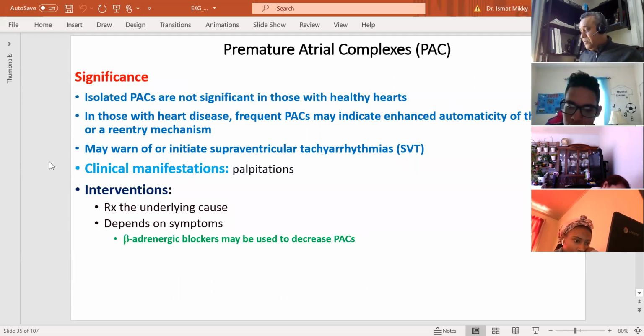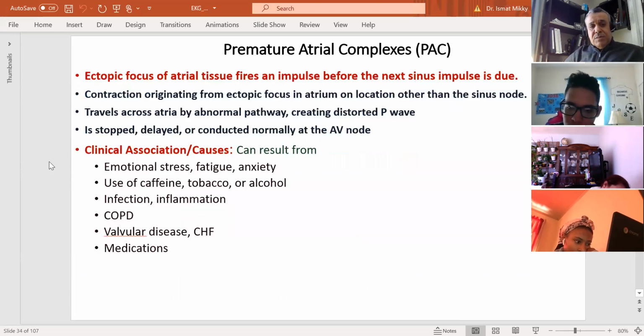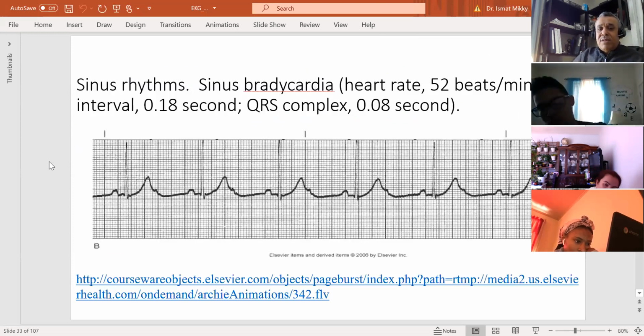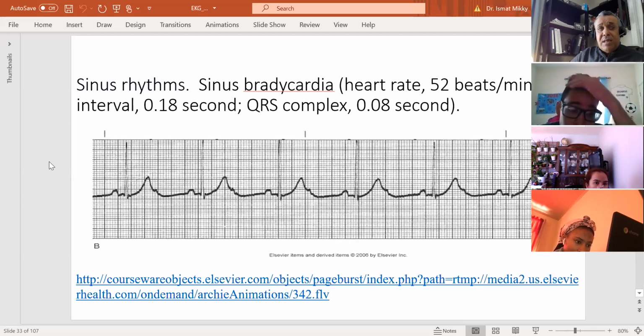But the T wave looks like it's a QRS wave. Try not to focus too much on the T wave now, because EKG or ECG interpretation has classes that you go to in advanced courses. If you go to the ICU or CCU, you will spend months of classes to go over this stuff.